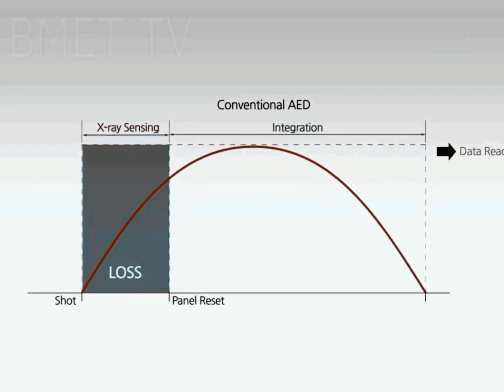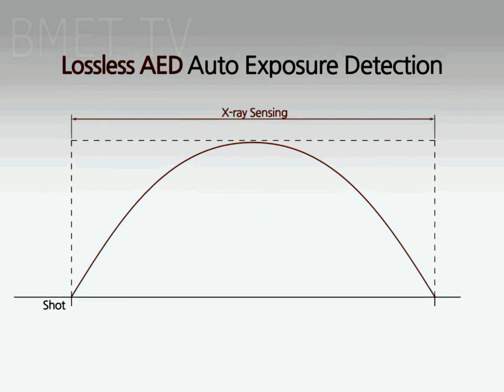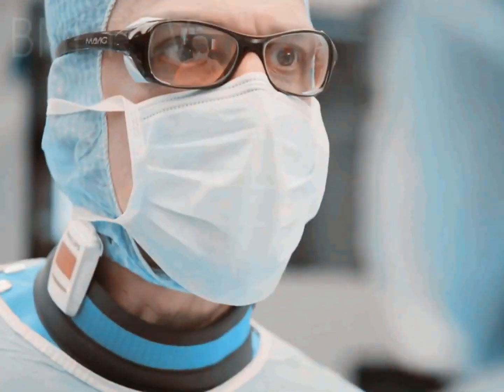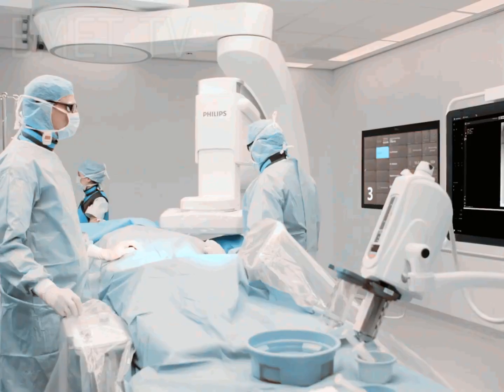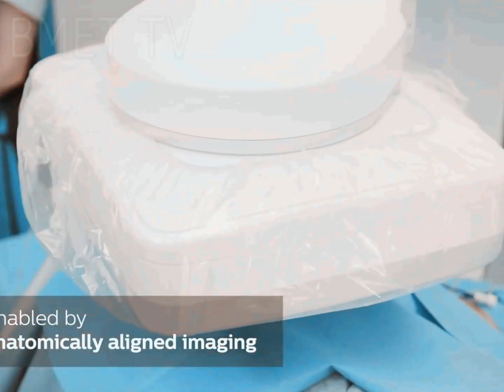The generator is the high-voltage, high-power source cath lab part instrumental in energizing the X-ray tube. It should be compatible with the X-ray tube and capable of delivering the full current capacity of the X-ray tube in cinemode. The collimation system, another integral cath lab part, helps to shape the beam of radiation emerging from the machine, limiting the maximum field size of a beam, therefore reducing radiation exposure to the patient.